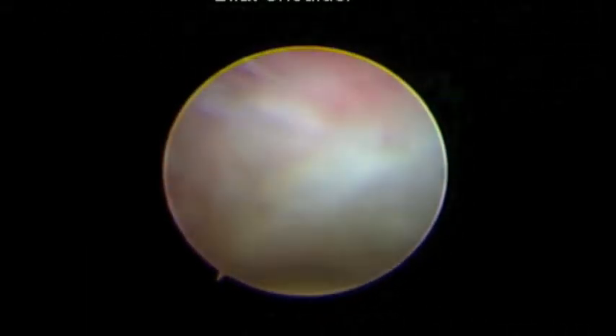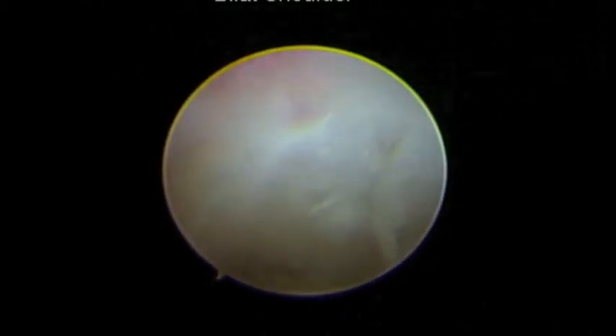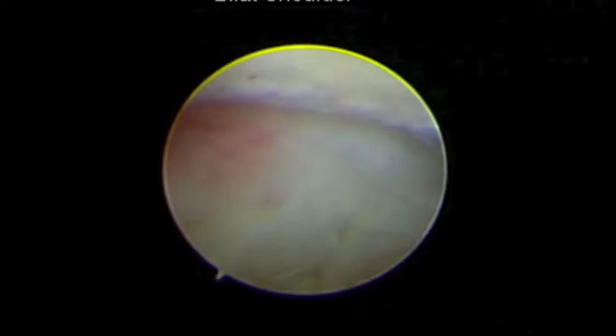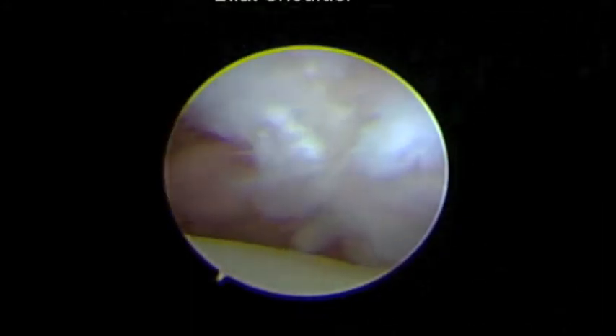That's your subscap, and those little things dangling right there should be the MGL — the major stabilizer of the shoulder. It's gone. The tendon of the subscap is completely destroyed. You can see where pieces of it that attach to the bone are pulled off, and you can't see any normal fiber pattern. The labrum's torn. That's the rest of your MGL there — the main stabilizing ligament just floating.